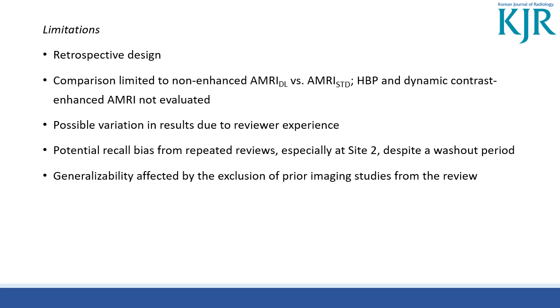Our study has some limitations. First, its retrospective design may have introduced selection bias. Second, we only compared non-enhanced AMRI sequences without evaluating the added value of hepatobiliary phase. Third, the results may vary depending on reviewer experience, as only experienced reviewers participated in our study.